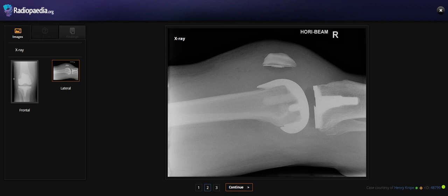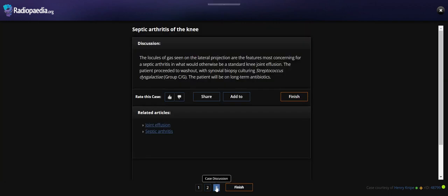So what is the diagnosis for this finding? This finding is indicative of septic arthritis of the knee. The gas lucency seen on the lateral projection is a feature more concerning for septic arthritis in what would otherwise be a standard knee joint effusion.